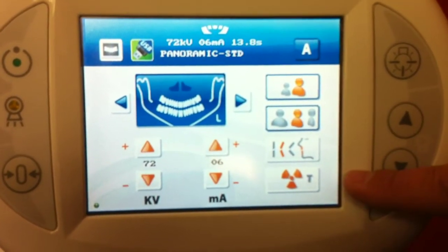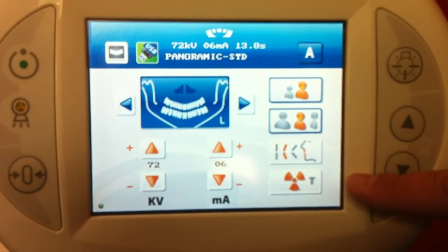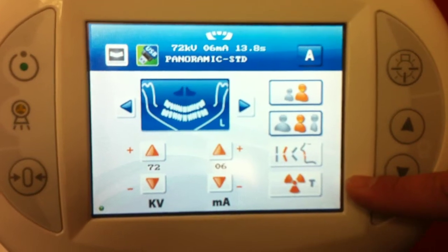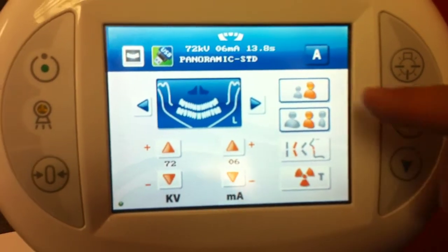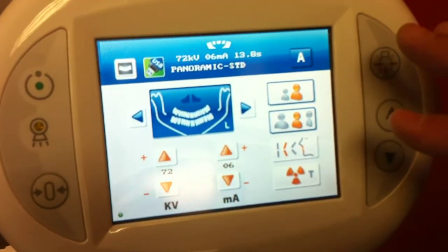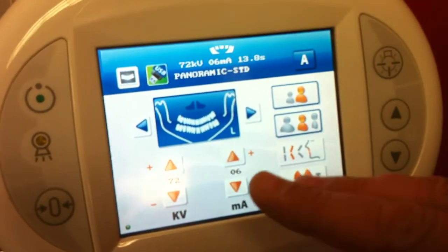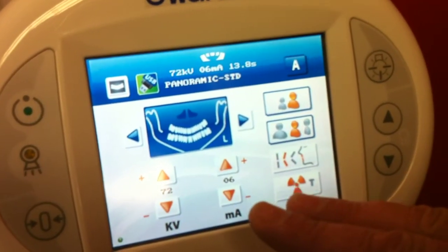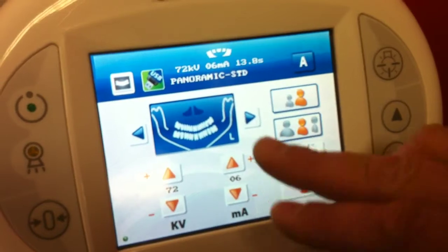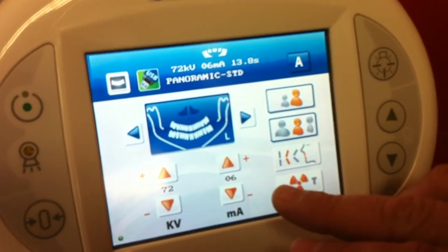This is a test mode setting for technicians. And once you have your patient selected, all the exposure parameters are predetermined but adjustable here and here.